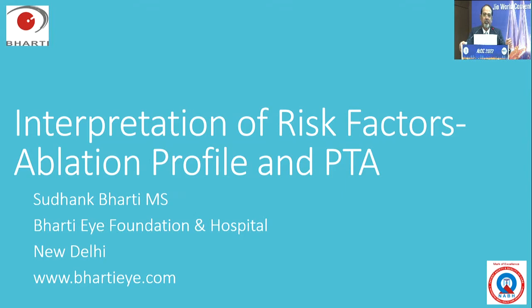and that practice I've been doing for more than 30 years, because we got our ALK system very early in my practice, which is now 37 years old. And I can tell you that even after correcting very high myopia with automated lamellar keratoplasty, where we used a Chiron Technolas system to correct the myopia with the microkeratome, I did not get a single case of ectasia in initial time.